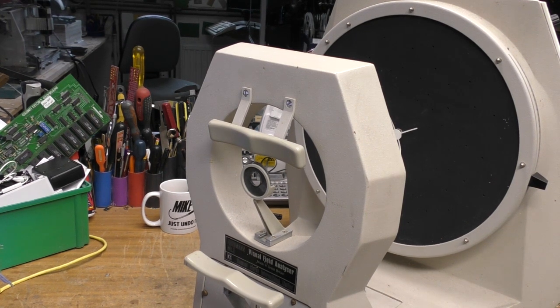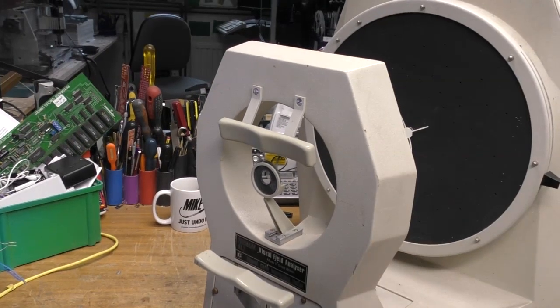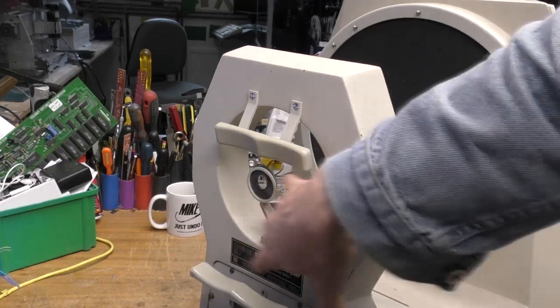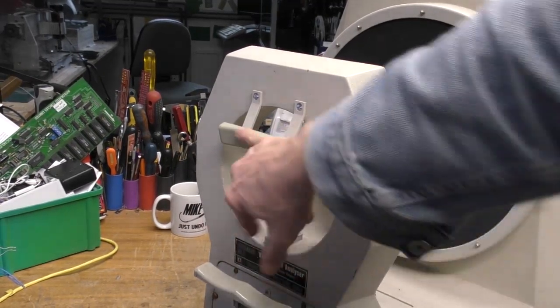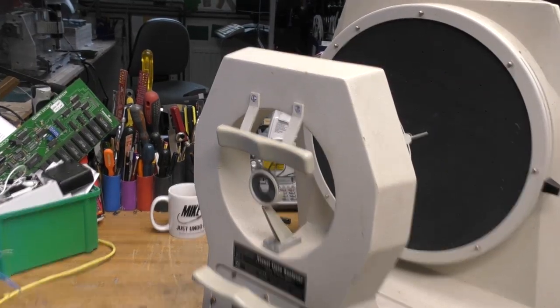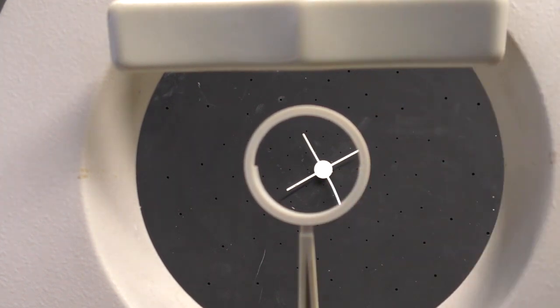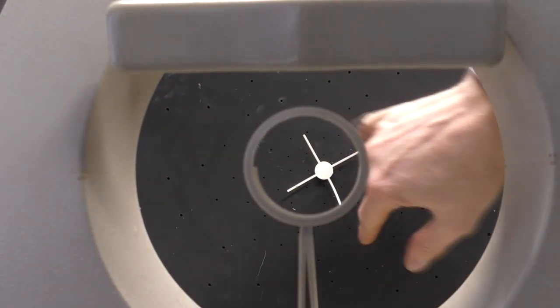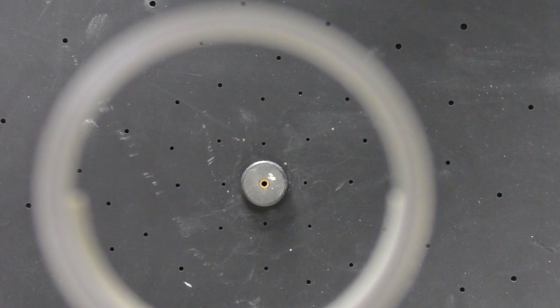So basically what this is, the patient sits on this side, and we've got this adjustable height chin rest, so you'd rest your chin on there and your forehead on here, and obviously you'd do each eye separately, so you'd go one side or the other depending on which eye you wanted to examine. And you'd look through this eyepiece at the crosshair in the centre, and then the operator will press a button, it will flash two, three or four very small lights here. So when you press the button, you get some very short flashes.